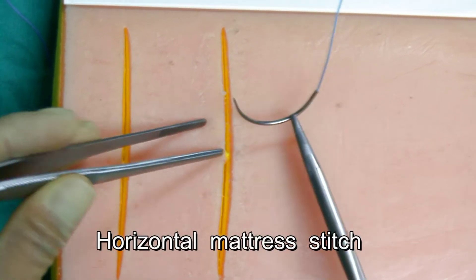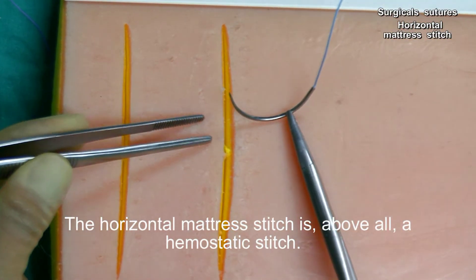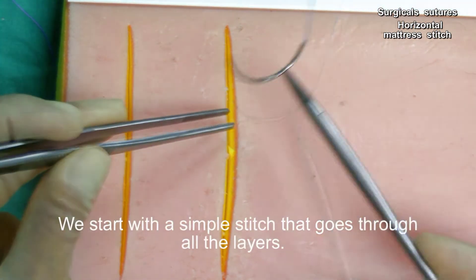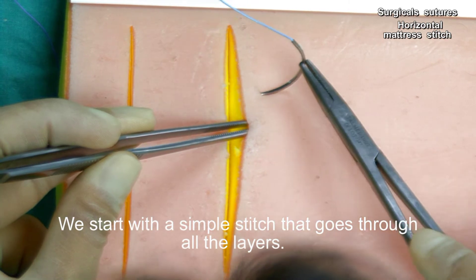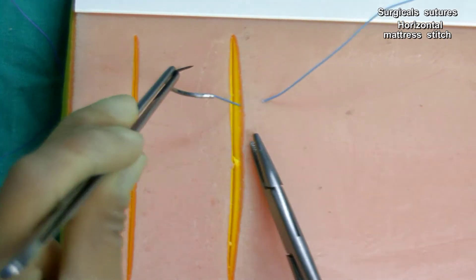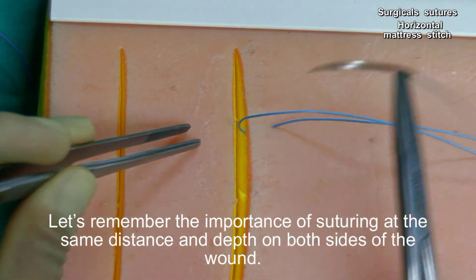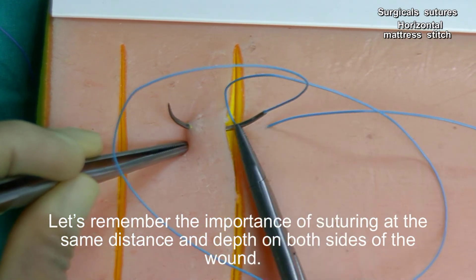Horizontal mattress stitch. The horizontal mattress stitch is, above all, a hemostatic stitch. We start with a simple stitch that goes through all the layers. Remember the importance of suturing at the same distance and depth on both sides of the wound.